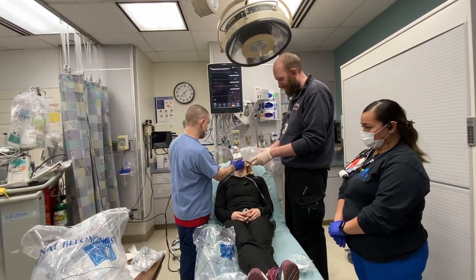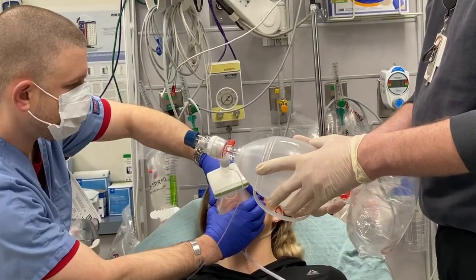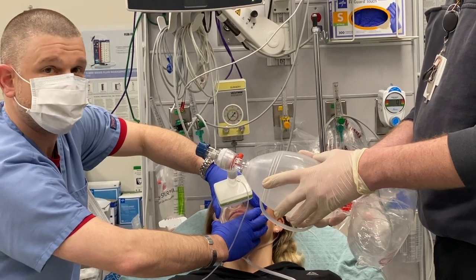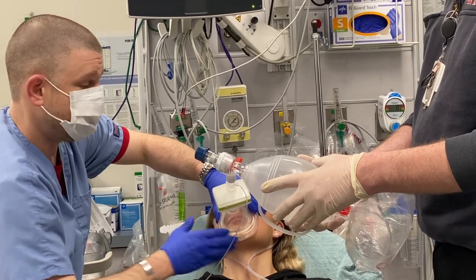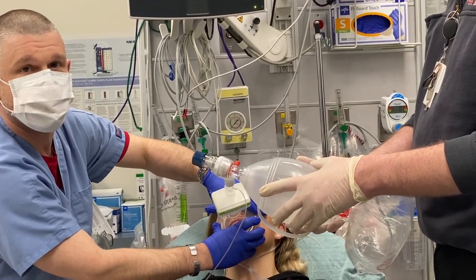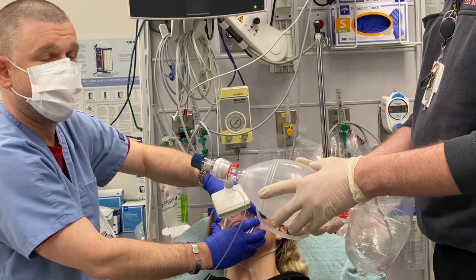Are you still breathing okay with that, Jordan? Okay. Breathe in and out real good to see if we have any leaks around this. Okay. Now I'm feeling all of her exhalation come out of that port right there where the PEEP valve is. And that's a good sign because all of that is filtered gas. Okay? If I'm feeling anything coming out of the mask, then that's contaminated gas, and that's what we want to avoid. So it's really about putting the mask on with a good seal. Okay? We'll see you for the second video on the intubation procedure.